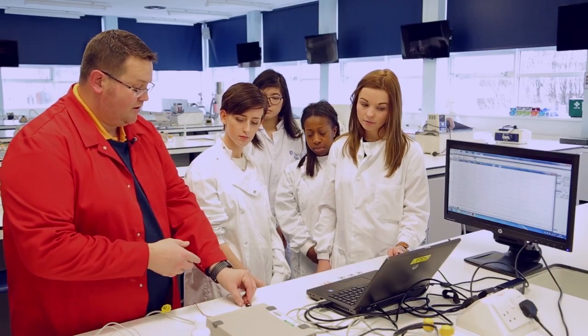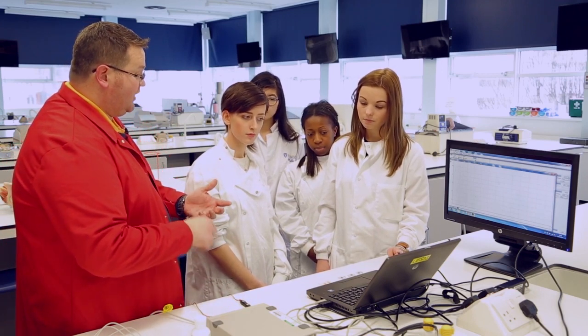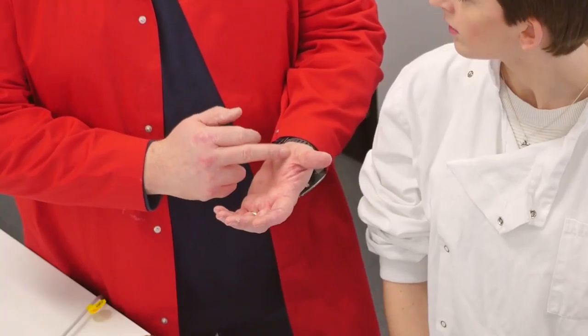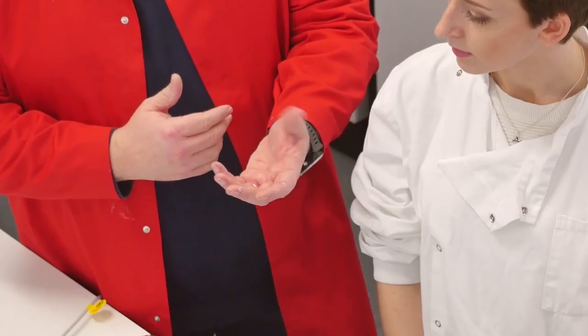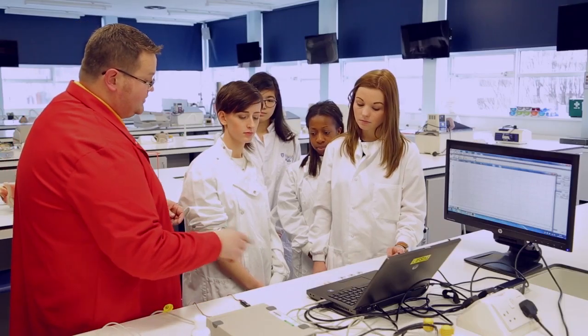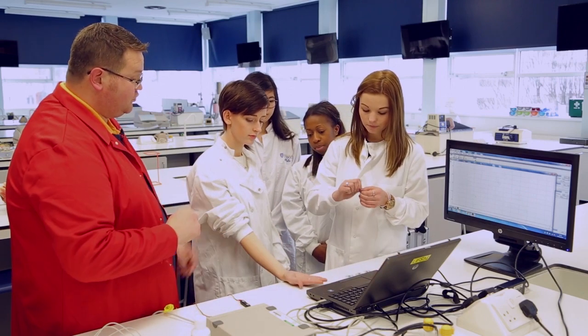We need a way of stimulating and also a way of recording. We'll have a set of recording electrodes placed onto the thumb which will allow us to monitor any sort of depolarization or movement and activity that occurs as the thumb gets drawn over to the little finger.